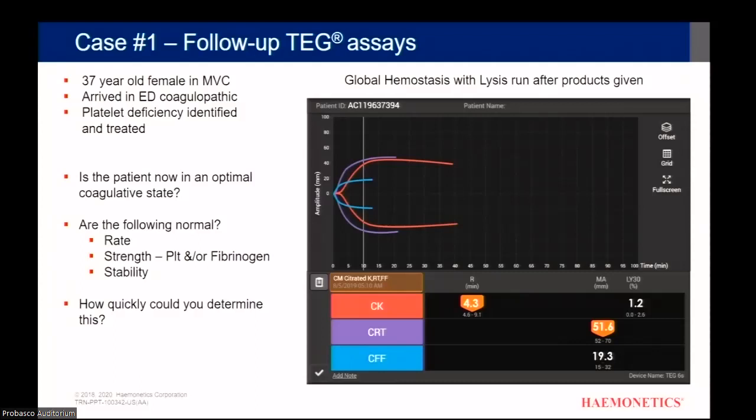So for the cartridge system, there's no way you're going to get all the data every time. Does that make sense? So what was your question? I guess what's the difference between a GH assay and then adding the platelet mapping? It's just the addition of the rapid TEG and functional fibrinogen data. The GH is our normal TEG. The mapping is a separate one.